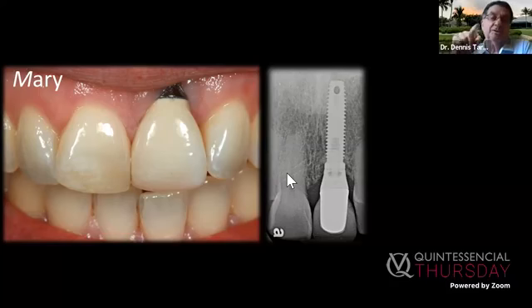So the first thing you have to check is, is the implant healthy? We'll come back to that a little bit later. But this is a key thing. Is the implant healthy? Is it worthwhile to even go after? First thing you'll hear me say in the middle of this presentation and again, if the implant is unhealthy and has a cosmetic problem like this, take the sucker out.